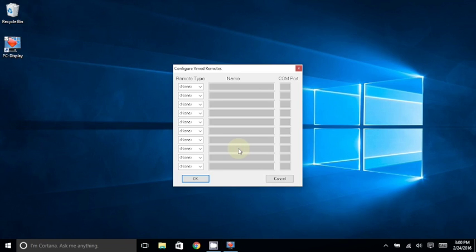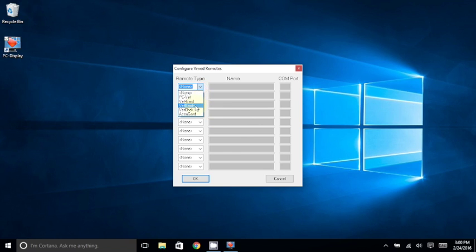At the top left, under Remote Type, you will choose the type of VMED wireless remote that you have connected to. In this case, it's a VetGuard Plus.